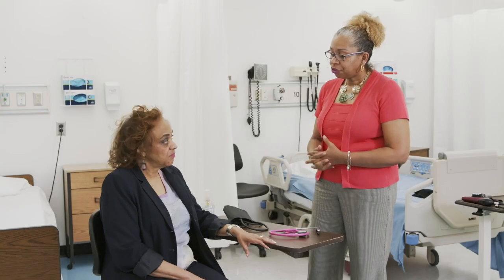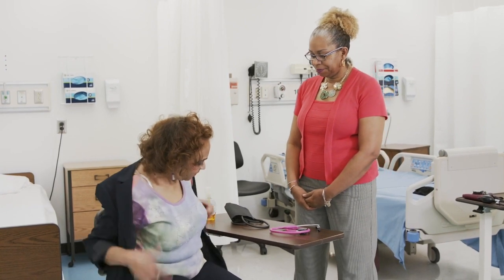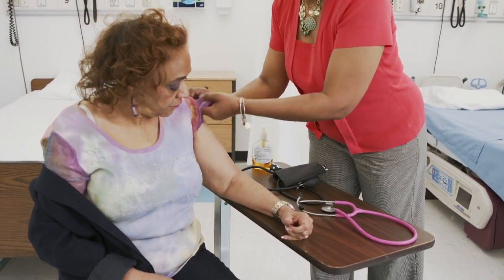When taking a blood pressure, the cuff should be placed directly against the skin of the arm. No clothing or material should be between the cuff and the arm. If the patient has on a long sleeve shirt or a jacket, ask the patient to remove the jacket or roll up the sleeve. If the sleeve cannot be rolled up or the patient cannot remove their clothing, you can place the blood pressure cuff over the clothing; however, this is not ideal.